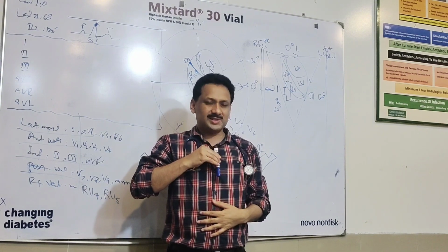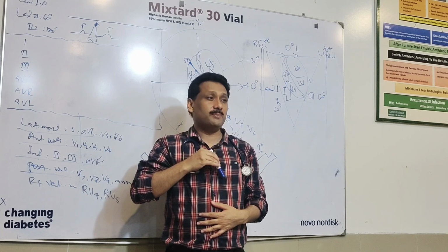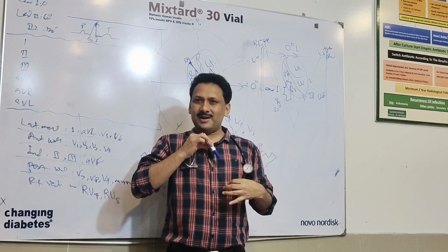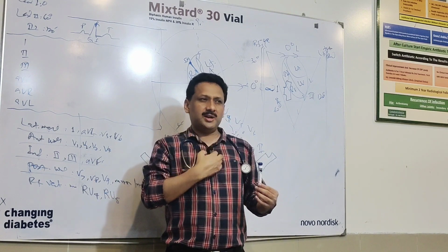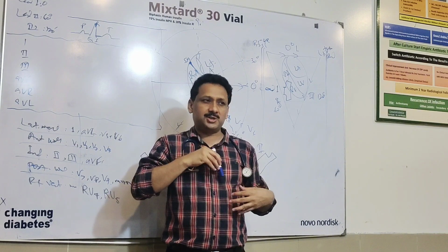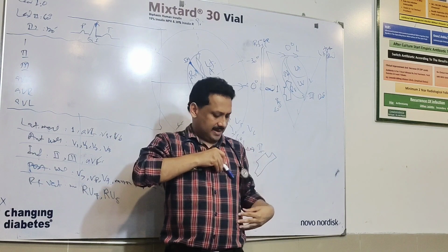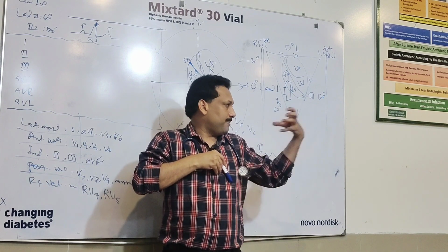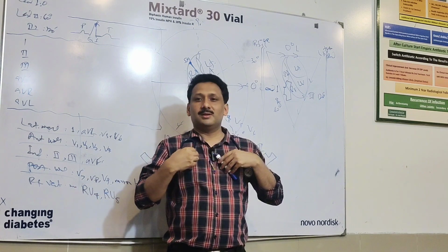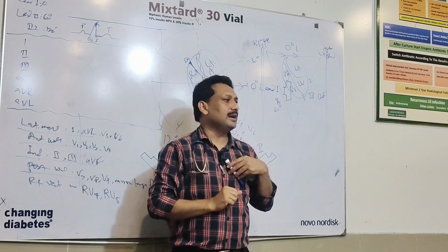So the current will deflect in the direction having more muscle mass. The current is going in all directions, but summing up, the maximum strength of current will be in the direction of the big size ventricle.